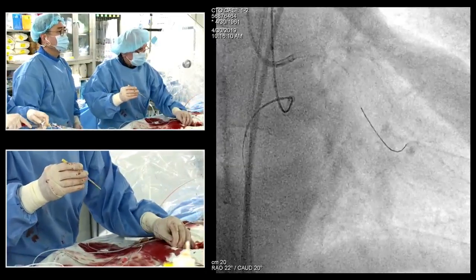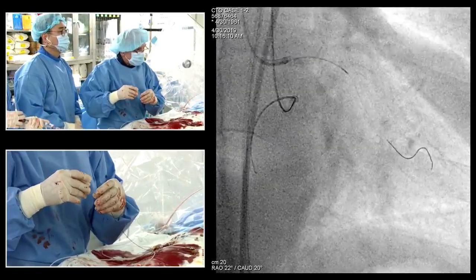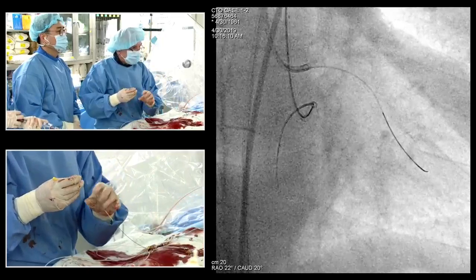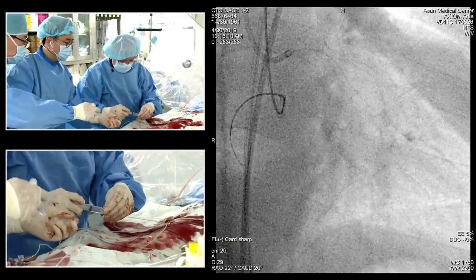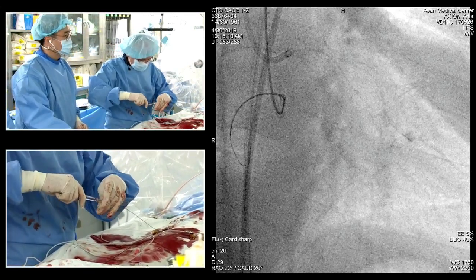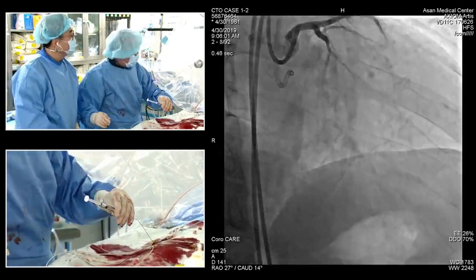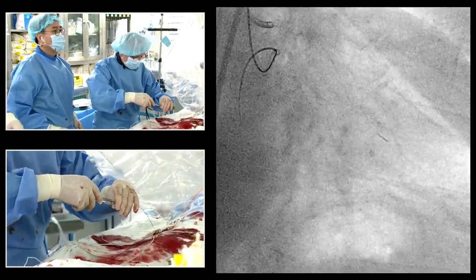So you're going directly for the epicardial connection there. I think this has the best score. Yeah. According to Paul Kang. Okay. Okay, yeah. Let's see. At least a super selective injection is worth it to see, really understand the complexity of this connection. Yeah, let's go. Probably, what is the best projection? I think this is quite good. And maybe caudal a little bit more. I'm not sure. Let's see. This is good, and also the cranial, which makes it a little bit longer.